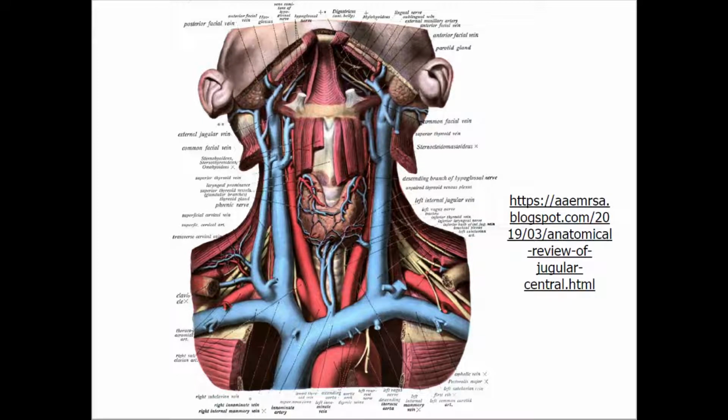And of course the relationship between the artery and the vein changes as we travel from the top of the neck to the bottom of the neck. Note how the subclavian artery lies behind the jugular vein, lower in the neck. So it's easy to go from the front wall of the vein through the back wall of the vein into the subclavian artery if you're doing an insertion very low in the neck of a patient. So this is a very important image to always keep in your head. There have even been punctures of the aortic arch described while attempting subclavian access.